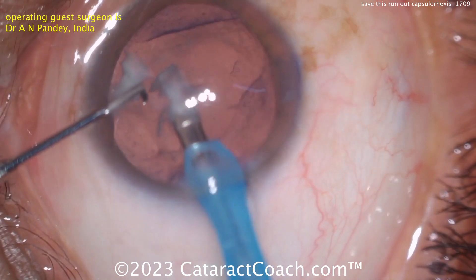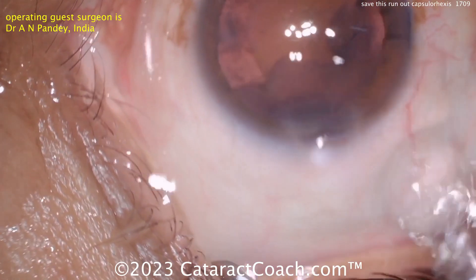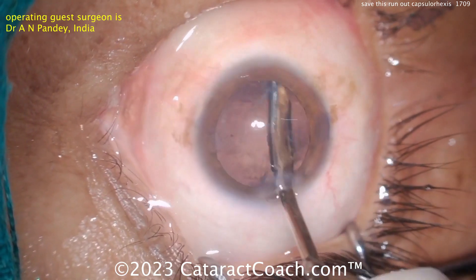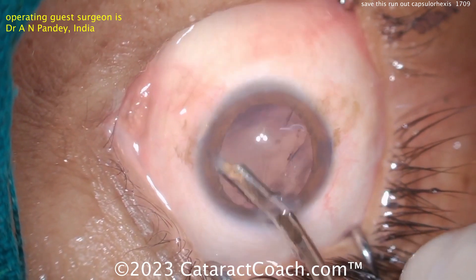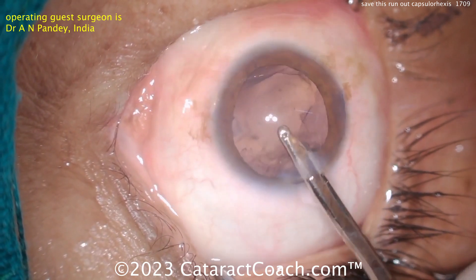That's a very nice outcome. Think of the before and after — this patient went from essentially zero vision with that white cataract to coming out with great vision. Now, cortex removal: be very cautious in that one area. A bimanual approach can sometimes be easier to give you more access, separating the infusion from the aspiration.